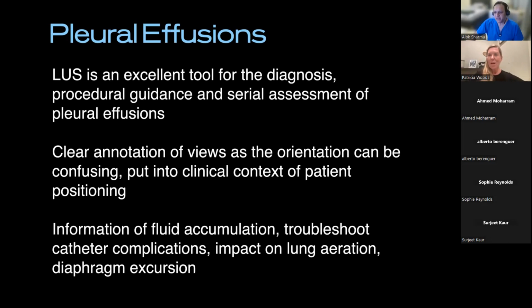Okay. So there's another question on whether the baby's position interferes with volume estimation, or is there a particular position in which you measure it? Do you like the baby supine? Do you like to move from above, below, or? I think about how our babies are nursed most of the time.